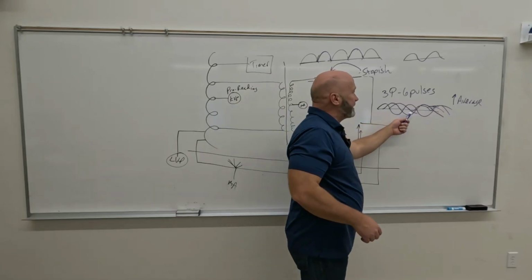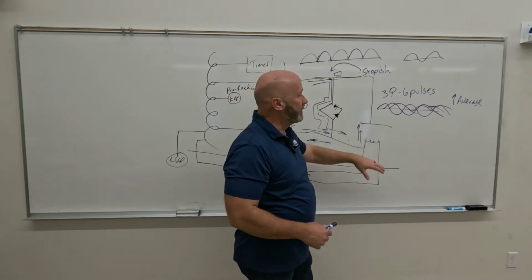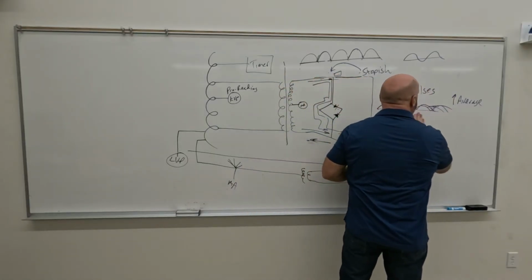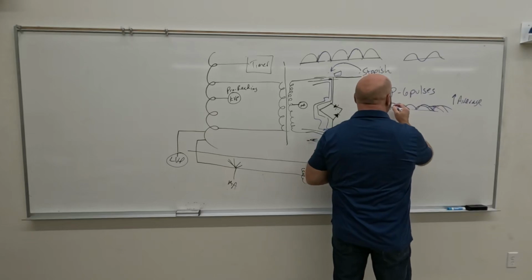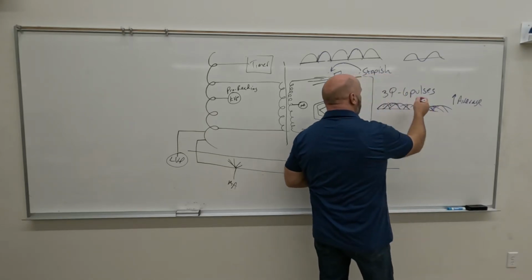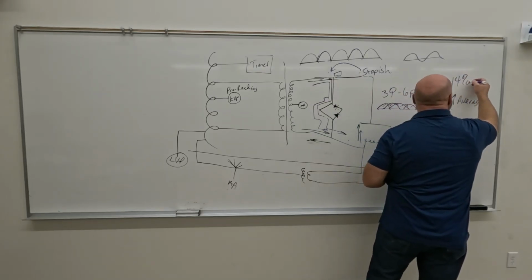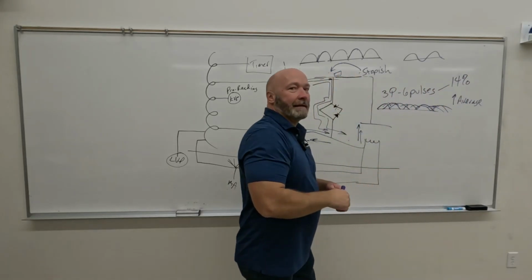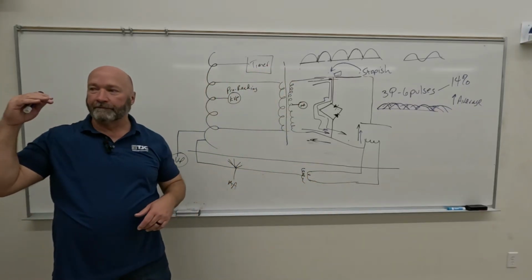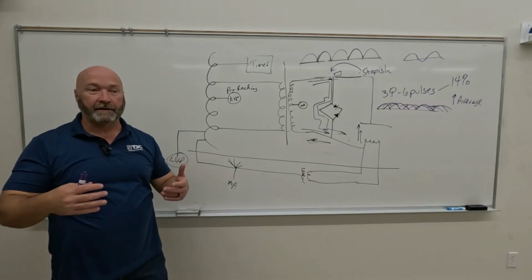Even with three phase unrectified, it's not 100%, right? But by the time we flip the negative side up, all of these valleys are going to be spackled in even more. And so three phase 6 pulse is going to give us about 14% voltage ripple, meaning that the peak energy doesn't drop more than 14% throughout the exposure. So your average kVp increases.